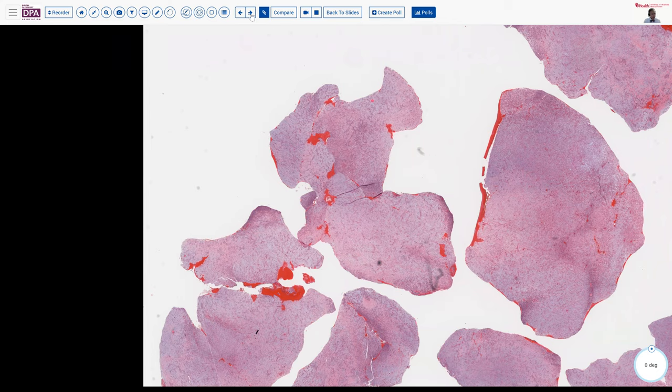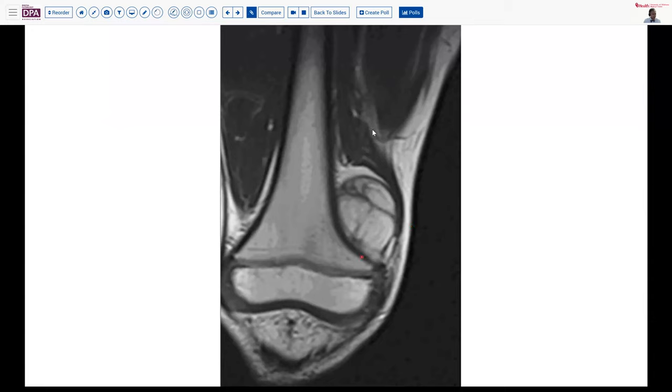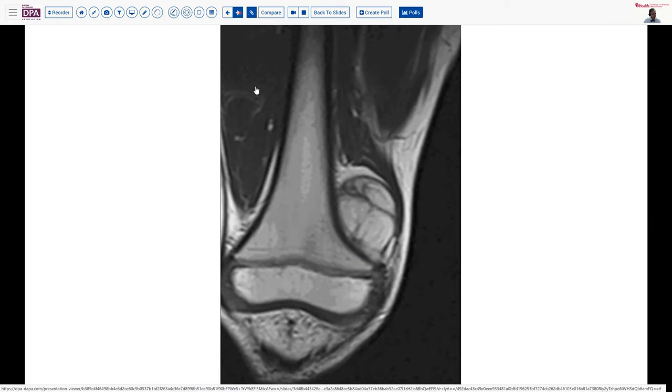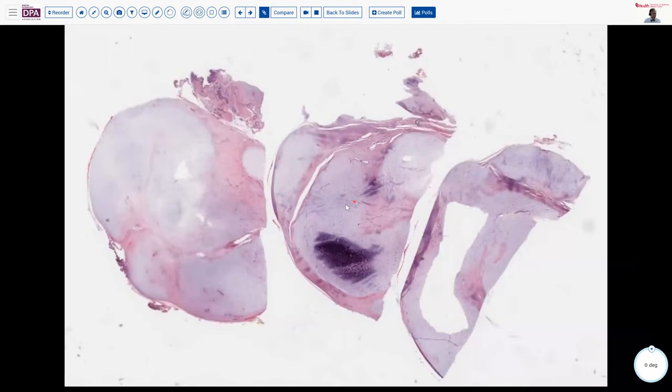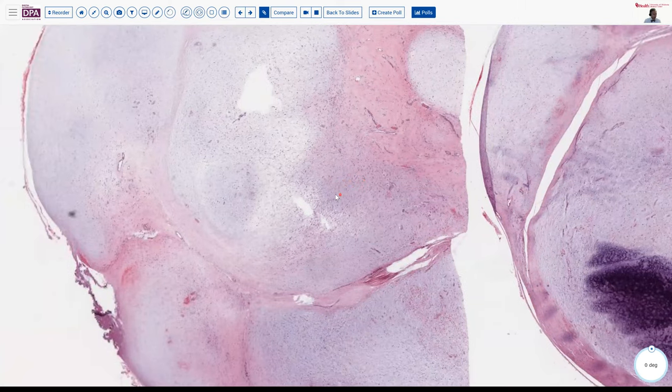All right, so chondromyxoid fibroma, another lesion in the chondroid differential diagnosis. This lesion, again, I did a video on this a few months ago, a patient with pain in his knee and this soft tissue mass, which we see here is entirely extracortical, doesn't involve the cortex on this MRI, young patient, still with open epiphyses. And this is just presented as a nice histologic differential comparing to the chondromyxoid fibroma. This is a pure myxomatous type of lesion without the chondroid elements.